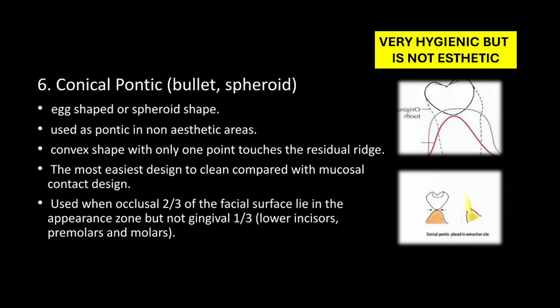This is our conical Pontic, bullet shaped or spheroid. Here it is. This is never used in the aesthetic zone. It's usually on molars and on people who the doctor's afraid will not take care of their teeth. So doctors do this, and they know their patients. They know the ones that are going to comply and the ones that don't. And they'll do this. I've seen us do this a few times, not much. It's not aesthetic at all. That's why it's only done in the posterior area.